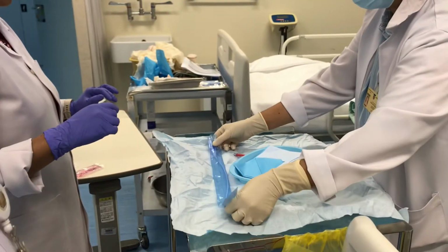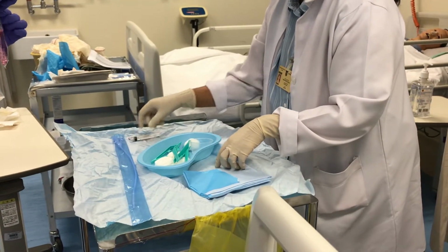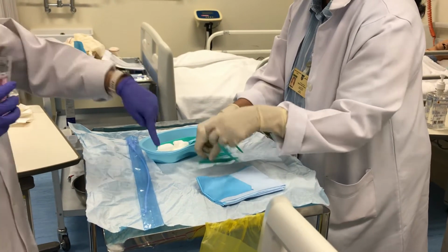We keep it here first. Let me keep it in the solution. Do it to the side. Keep it to the sides.